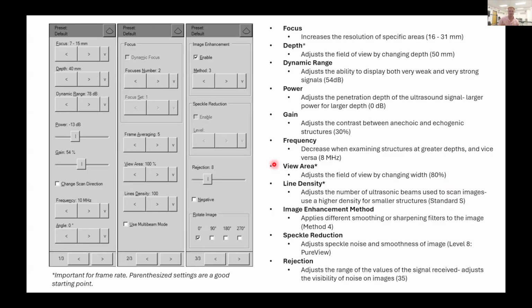While it's important for fascicle tracking to have clearly identifiable deep and superficial aponeuroses and line-like structures, your fascicles, it's just as important to have a really high frame rate with these videos. If you have a low frame rate, the tracking is just going to perform really poorly. Typically, that higher frame rate is at the expense of image quality. Maximum frame rate of these systems is around 210 to 220 frames per second.